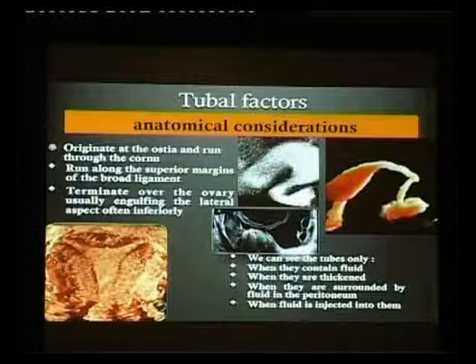But there's also the endometrial volume that we need to calculate using 3D technologies like VOCAL. In that case, we know that an endometrial volume of less than 2 ml gives a 15% success rate. More than 2 ml gives a 35% success rate. This is according to one of the studies done in the year 2005. And if the endometrial volume is less than 1 ml, there is no success.